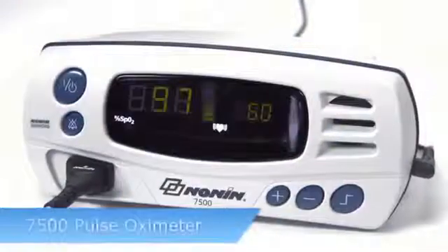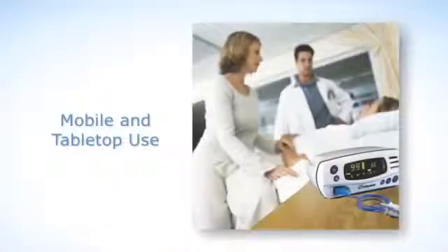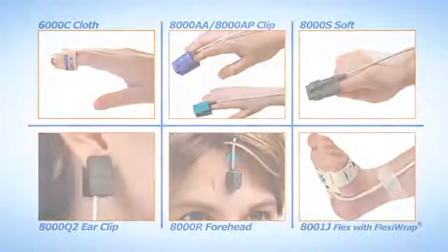The 7500 pulse oximeter model is designed for mobile and tabletop oxygen saturation and pulse rate measurement, and is compatible with a full range of pure light sensors from Nonin Medical.